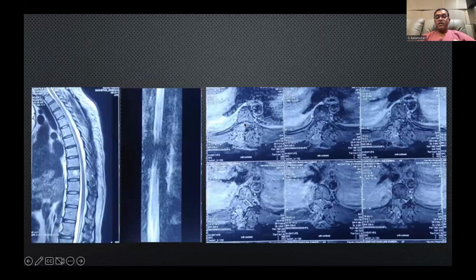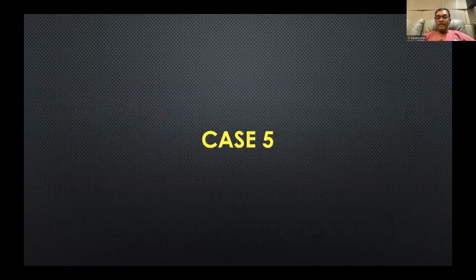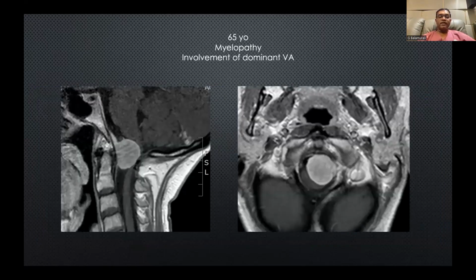And you can actually see the thoracic opening is much larger. I involved the thoracic surgeon to come and remove the part. So the tumor was completely disconnected from the intradural and the foraminal component posteriorly. And then the thoracic component was just hanging there to be grabbed by the thoracic surgeon. So again, he did extremely well with 5-year follow-up.